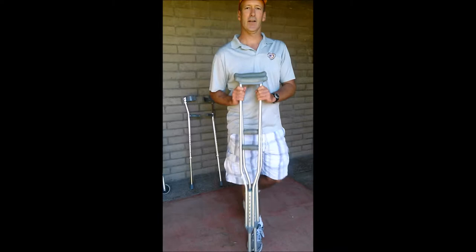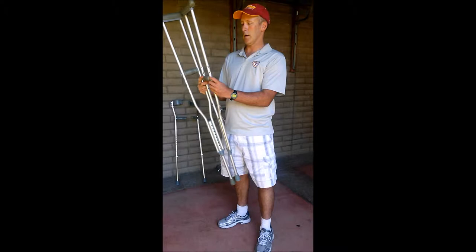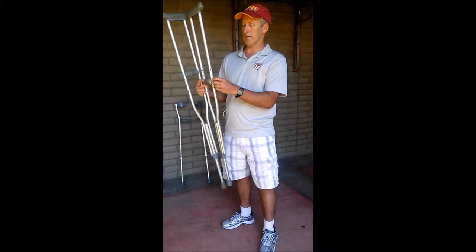We have our standard crutches here - this is an assistive device generally used for folks that need to go up and down stairs, and also for individuals that are pretty strong and pretty mobile. You don't see a lot of folks that have fractured their hip from a fall in their late 70s using crutches, but that does happen every now and then.